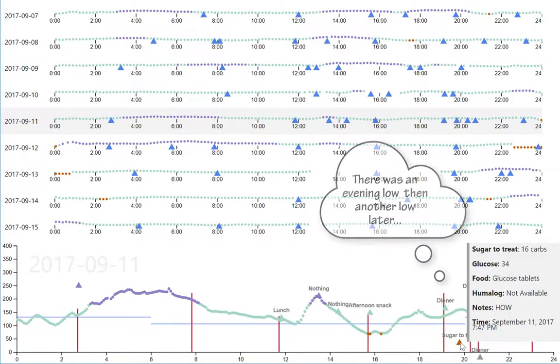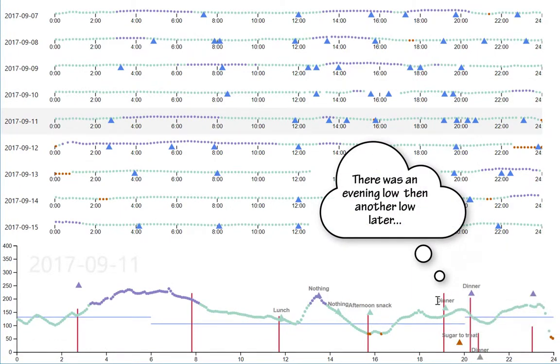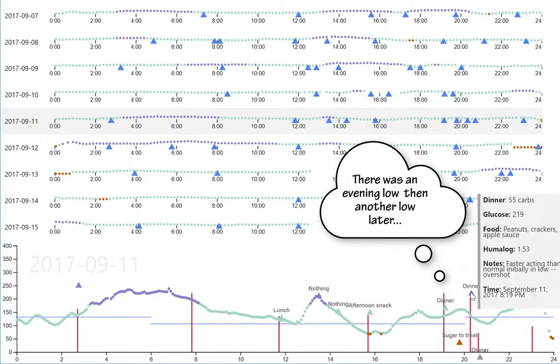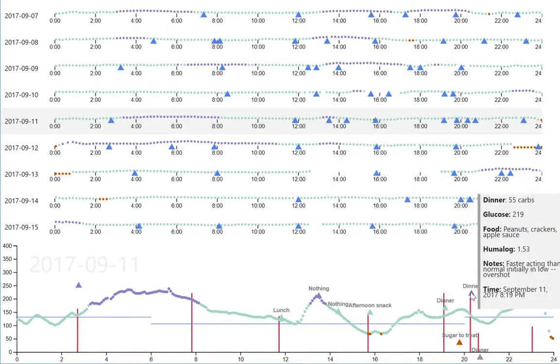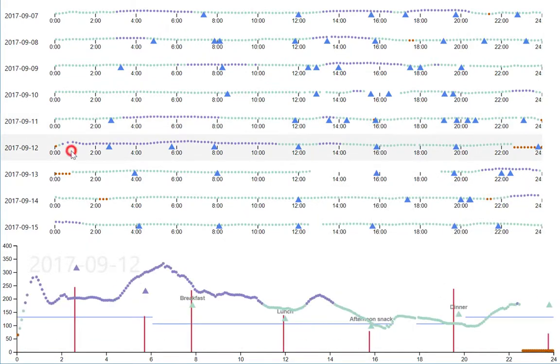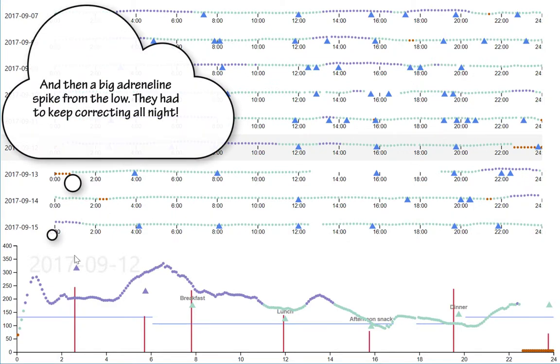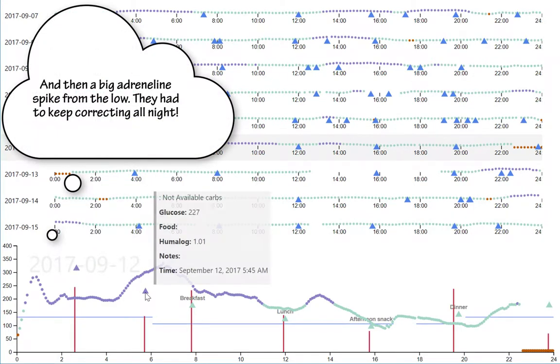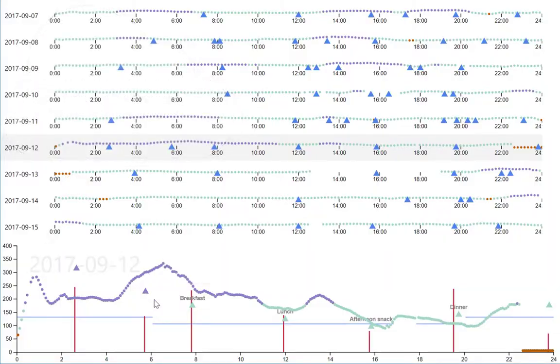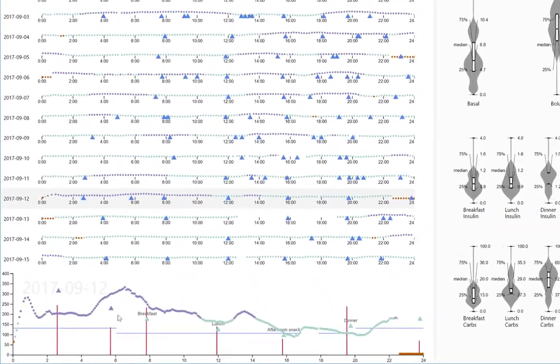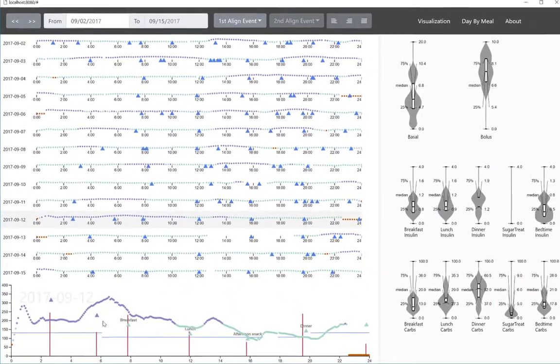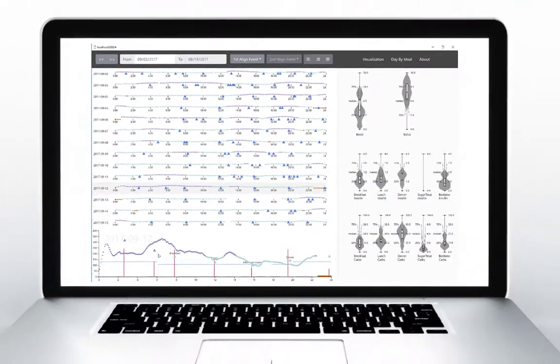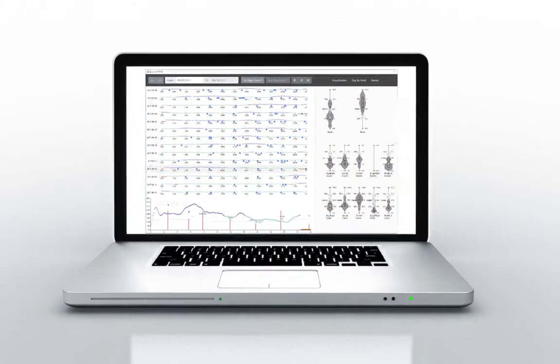The detail view shows us that there were lows before and after dinner, and then at midnight as well. Let's look at the next day. After midnight, there's a big adrenaline spike which caused high blood sugars, and the patient had to keep administering insulin all night to try to compensate. But good job overall.